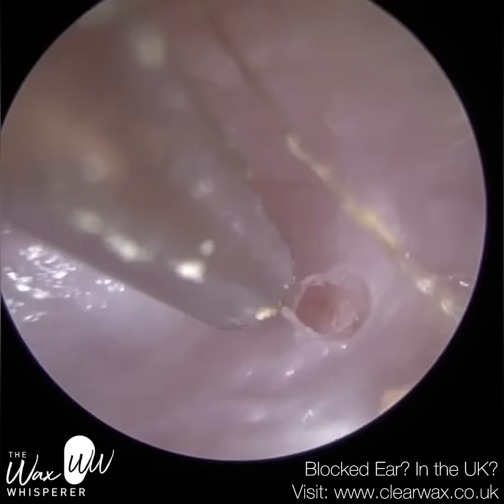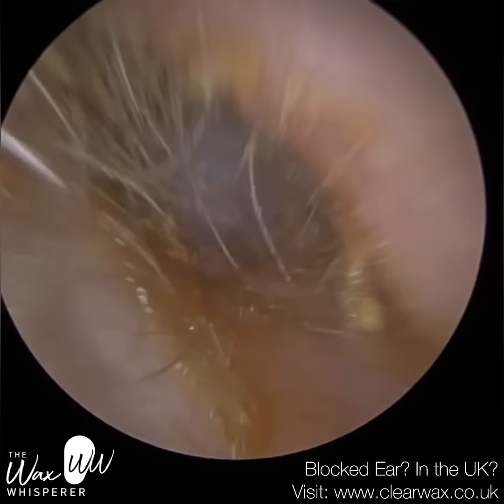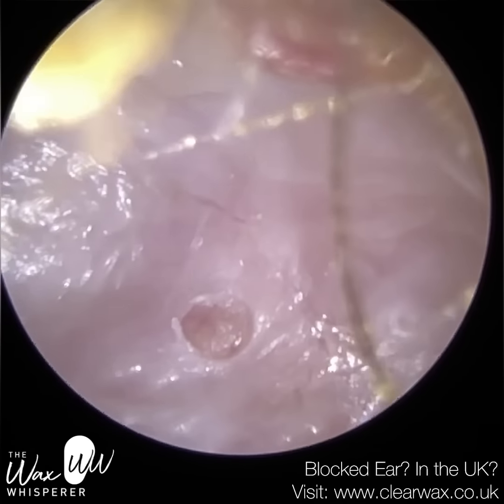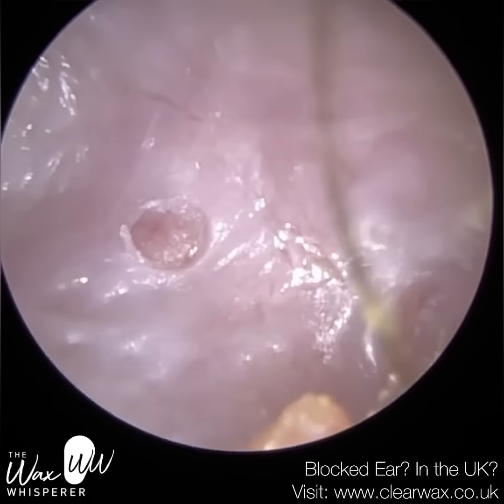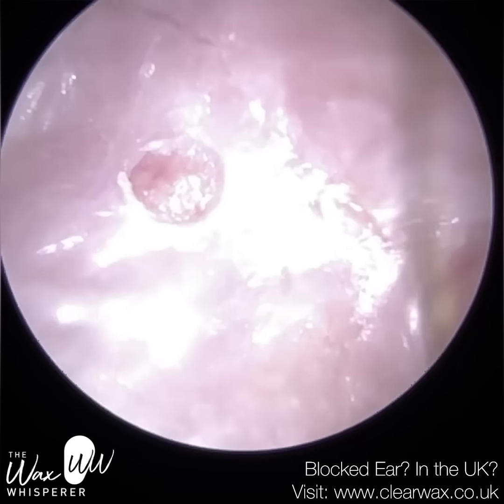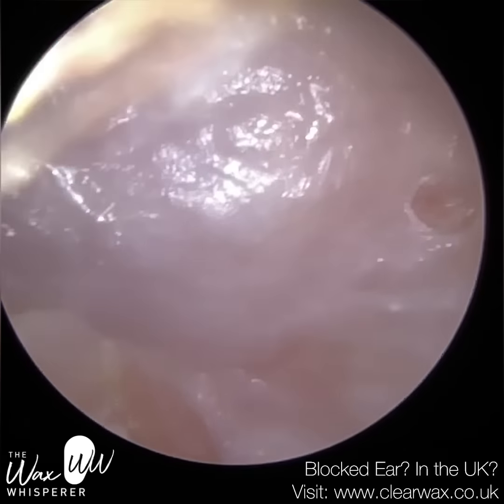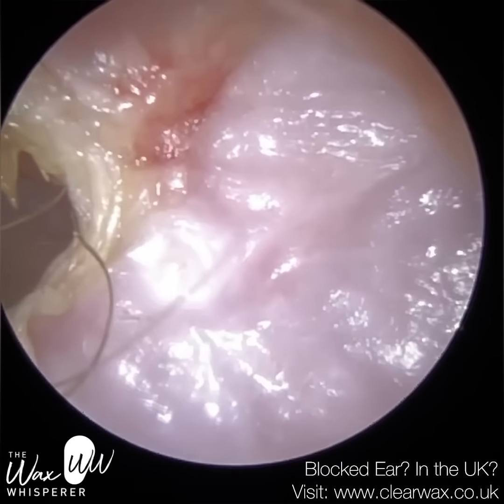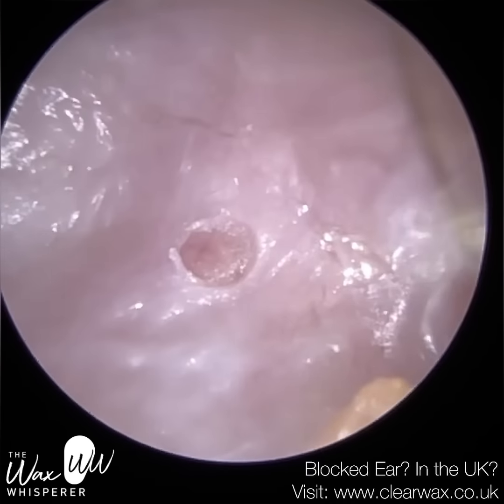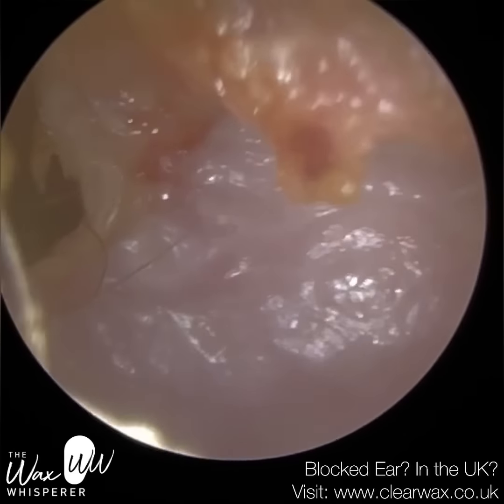And what I'm trying to do here, I just want to see that there's no exposed bone here, and there's not. So I'm not going to peel this away. It's too thick a layer of skin. This is going to need continuous debridement, and you're going to need this crater cleaned out on a regular basis, because you know this is just going to collect with dead skin and wax moving forwards. This can become quite serious. It can start eroding towards the jaw joint. So we have made a referral to ENT by the patient's GP.